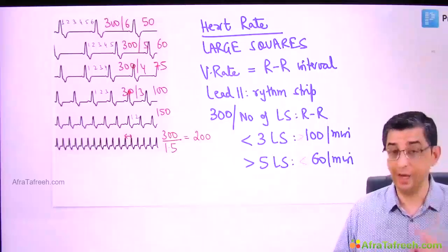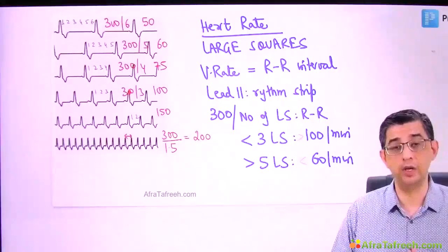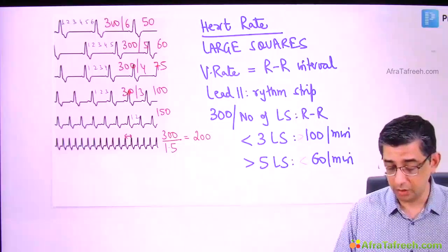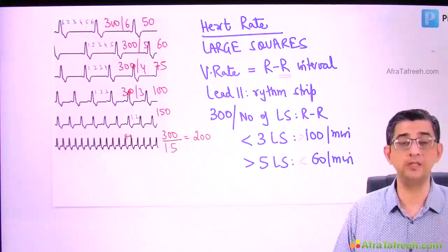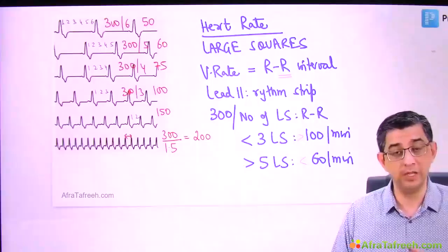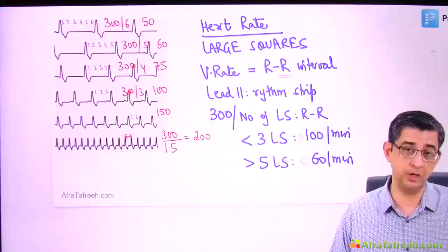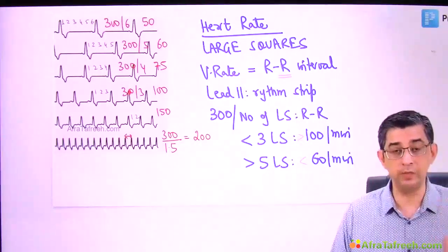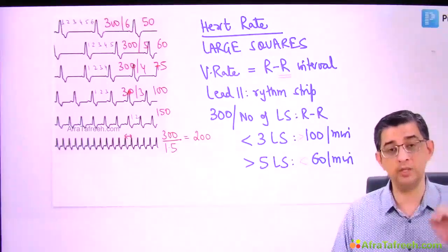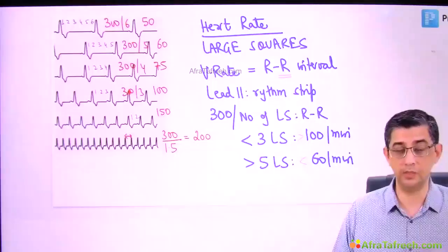Check out the heart rate at least twice, because I'm going to teach you conditions where there's going to be an irregular RR interval. If you missed this point, I'm going to say this again, guys. Don't check the RR interval only once, because lots of times there could be an ECG of atrial fibrillation or multifocal atrial tachycardia where the RR interval will be changing. If the RR interval changes, you just can't say by counting only one time, okay, this is the heart rate, because it is variable. These are 2 arrhythmias where we get an irregular pulse per se. I am highlighting the question right away. It could be a 3-liner, 4-liner. The keyword is irregular pulse. 2 times you're going to read it.